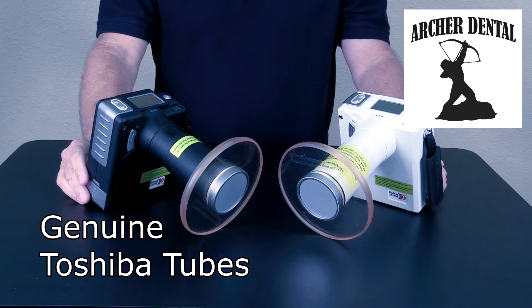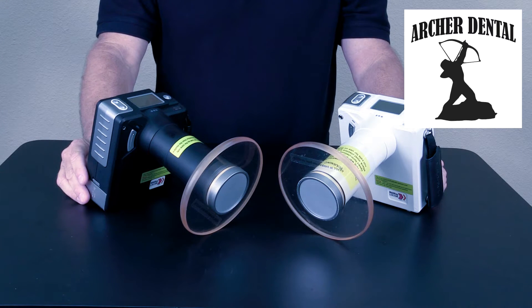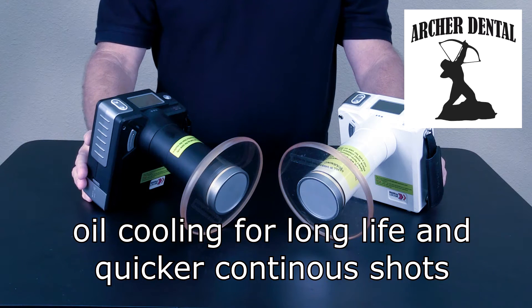This unit features genuine Toshiba mini x-ray tubes from Japan. Maintenance-free and oil-cooled for long life and fast turnaround shots.